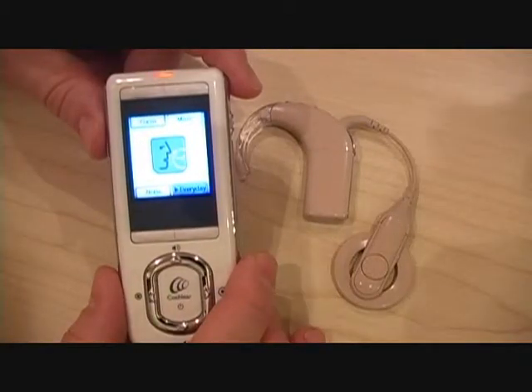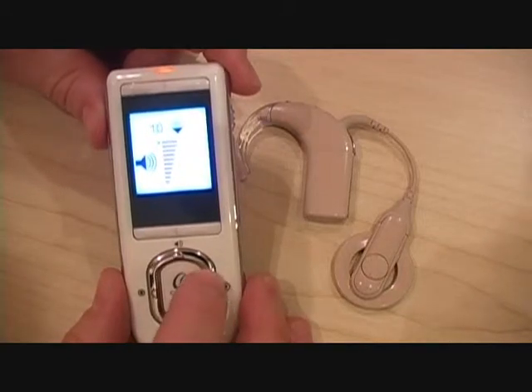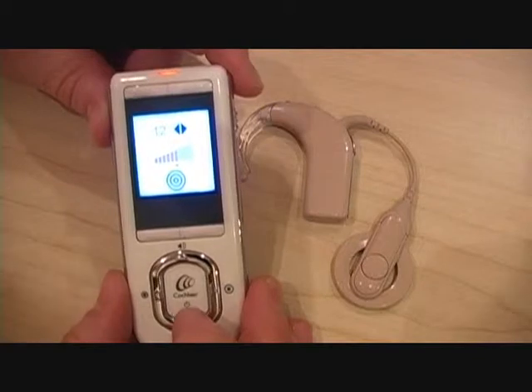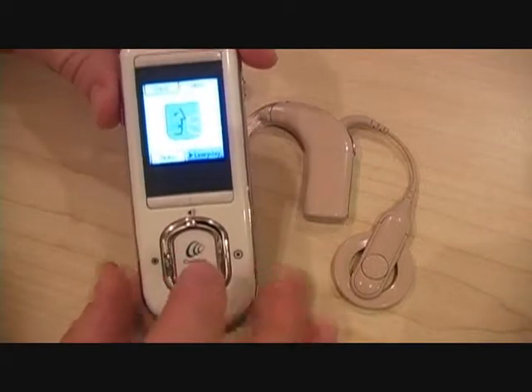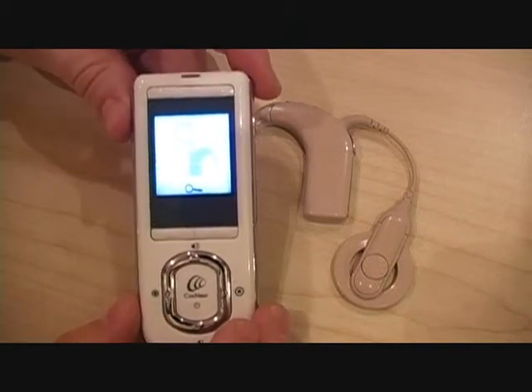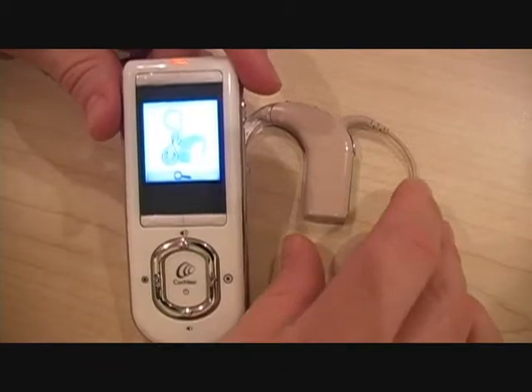If your telecoil is not active and your volume sensitivity settings are set at their defaults, then you'll want to check if your coil and cable are working properly. First, tap the Cochlear button on your remote. You should see an image of a processor and a coil with a coil out of position. Take your coil and place it under the remote.